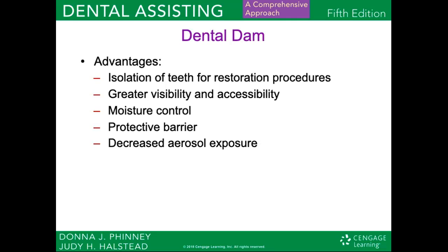So it isolates the teeth for restorative procedures. It provides greater visibility and accessibility, moisture control, protective barrier, and decreased aerosol exposure.